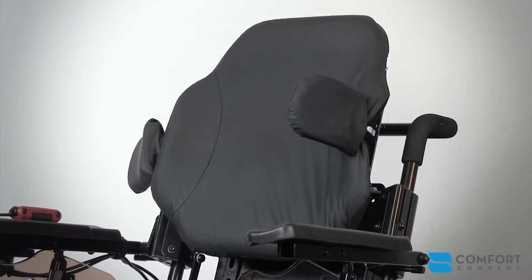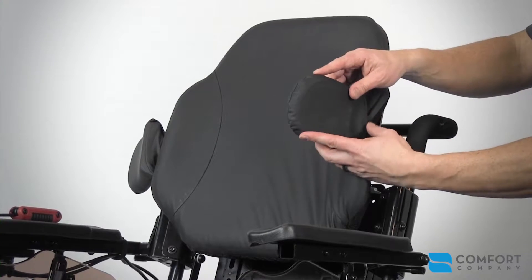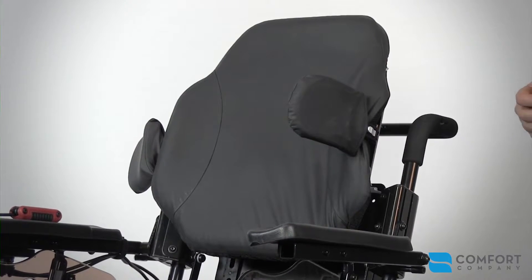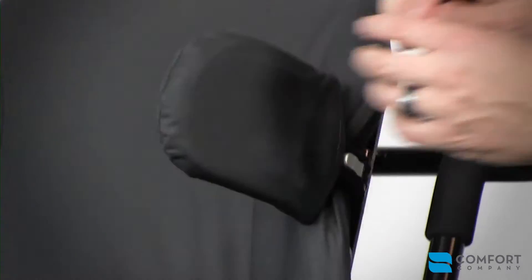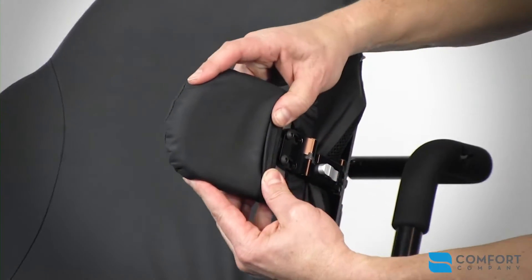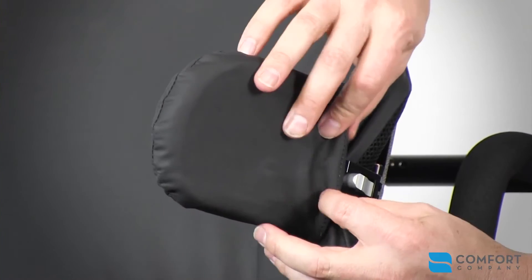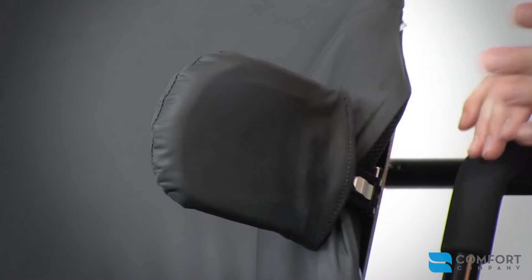The Comfort Company has developed a large offering of laterals, both fixed and swing-away. We carry two different pad shapes, two different fabrics, and you can add additional lengths to this design to extend the pad outwards more. Underneath the cover are two adjustment screws at the pad head, which allows for depth and rotational input. There are two more bolts that you can loosen to allow the arm to articulate lateral or medial.